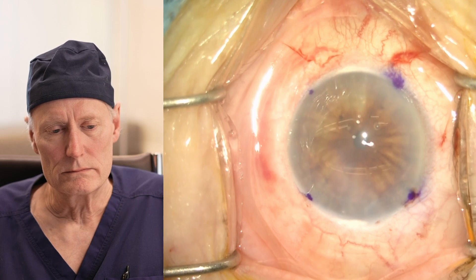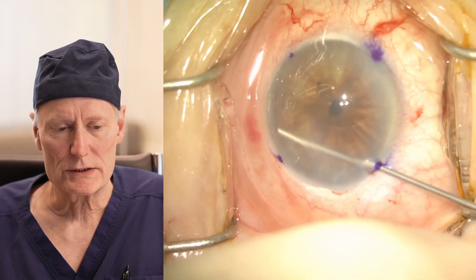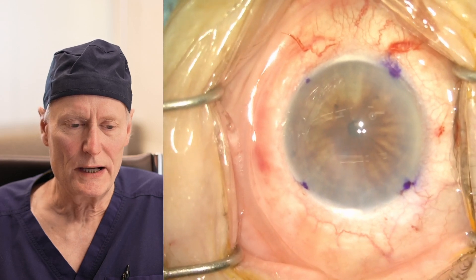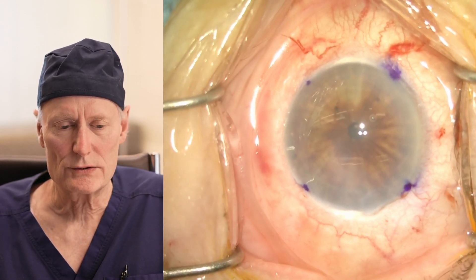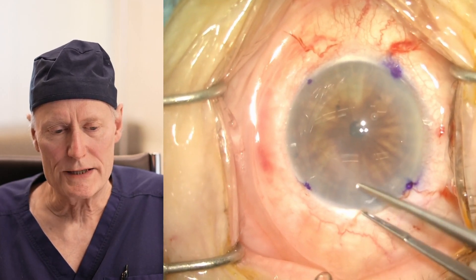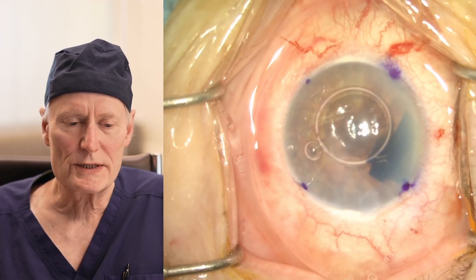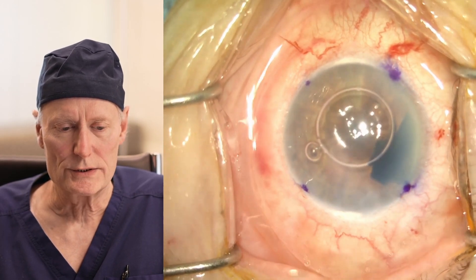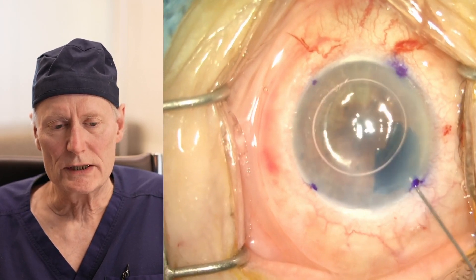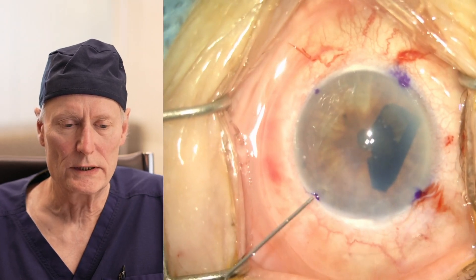This special salt water allows us to manipulate our transplanted cells more easily. First, we make some openings in the iris — this keeps the air we put in the eye from obstructing the natural flow of fluid. There are a couple of little openings at the bottom of the iris. Then we have a glass tube and we're going to put some new cells in the eye. You'll notice these are blue — they've been stained blue, and the blue stain goes away quickly, just hours, so it's not a permanent blue eye. This helps us see the tissue we're going to transplant.